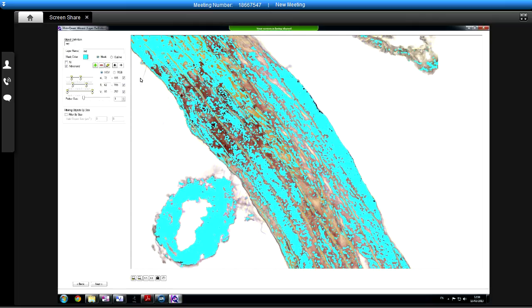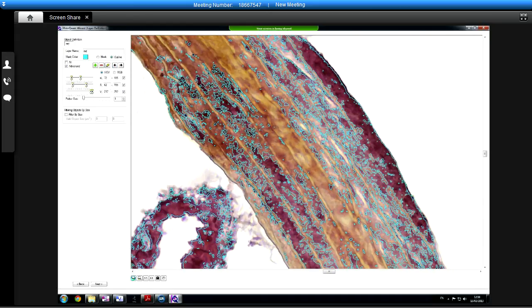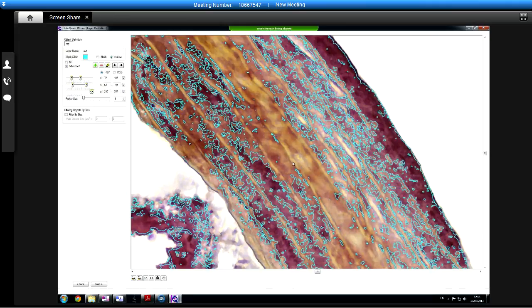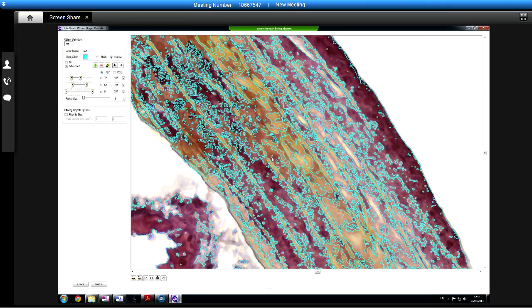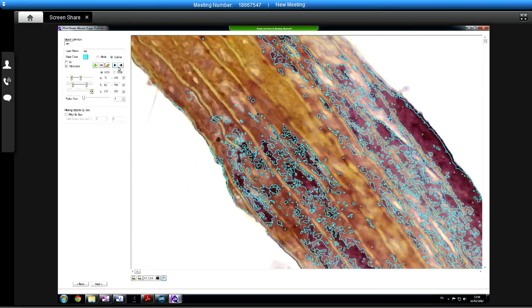So let's just zoom in a bit. Okay, so I guess here we need to be careful to do like this, but not this, don't we? But we're still marking this. This is not red, is it really? Saying that, if you actually look at it, this is, yeah, a little bit. This is the same colour as this, isn't it?